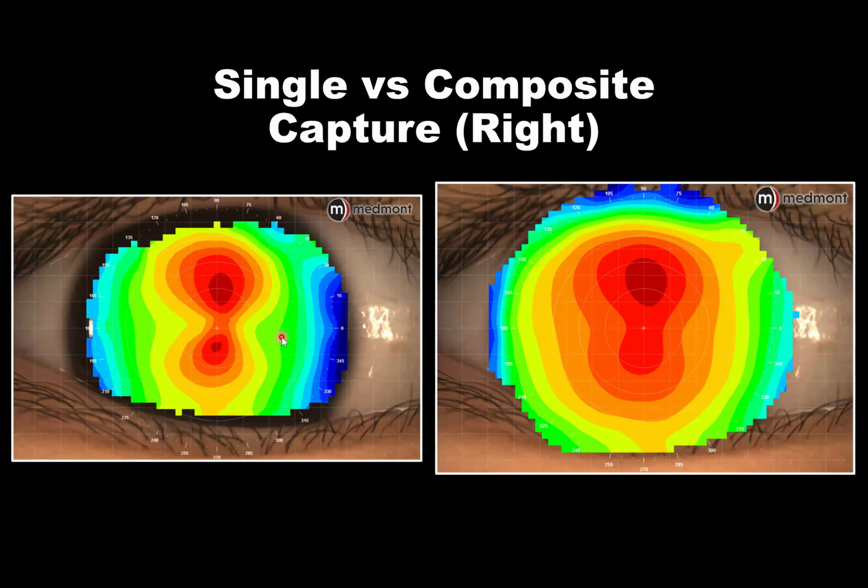Sure. Randy nos comenta de que muchas veces en la Academia de Ortoca o en otros simposios y en otras actividades, muchas veces se recibe casos en los cuales hace un mapa de la córnea, ¿cierto? Y entonces vemos como en el primer mapa quizás hay áreas que no están totalmente mapeadas, sin embargo, cuando hacemos la captura compuesta, pues sí.